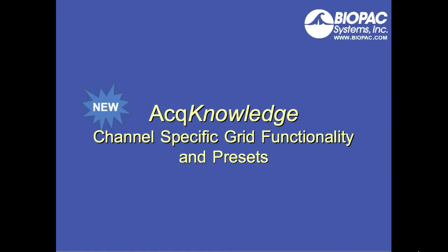In this screencast, we'll look at the channel-specific grid functionality and presets in AcqKnowledge.